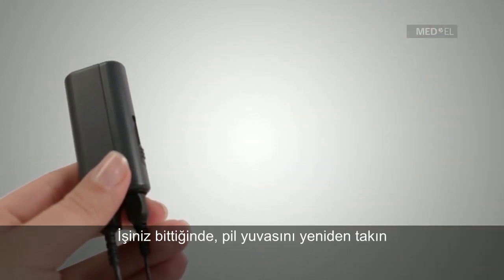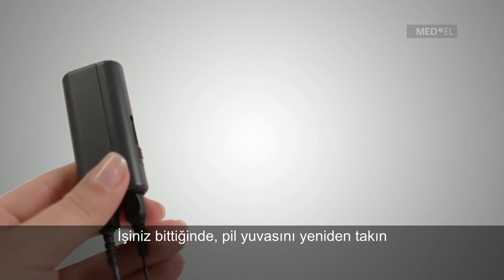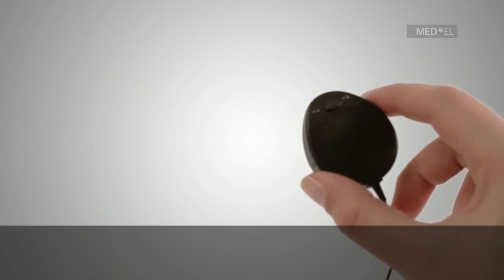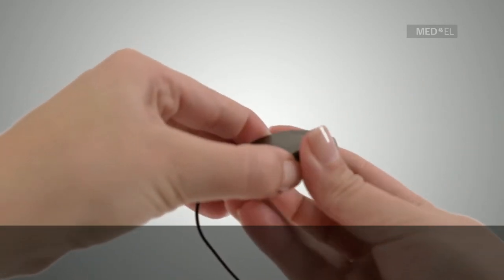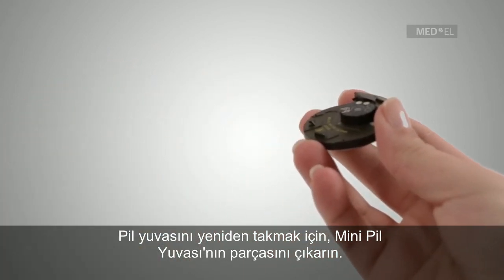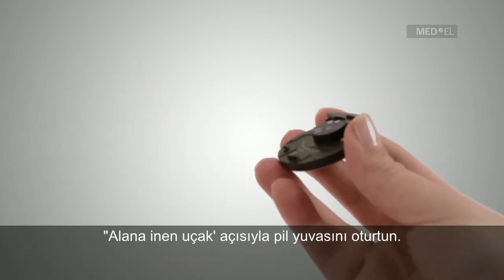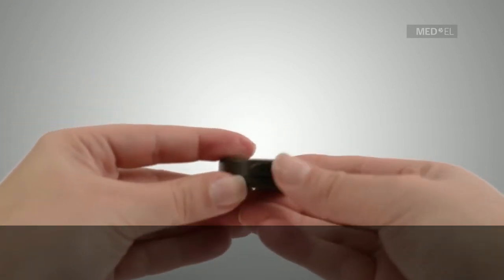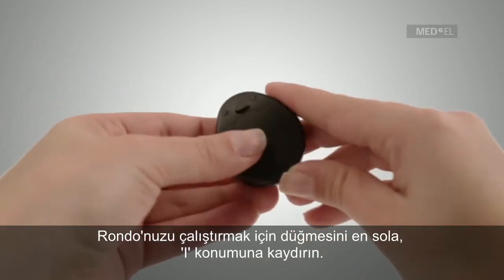When you are finished listening to music, reattach the battery pack. To reattach the battery pack, once the Rondo Connection Cable has been removed, use the gently landing airplane method. To activate the Rondo, shift the switch to the 1 position.